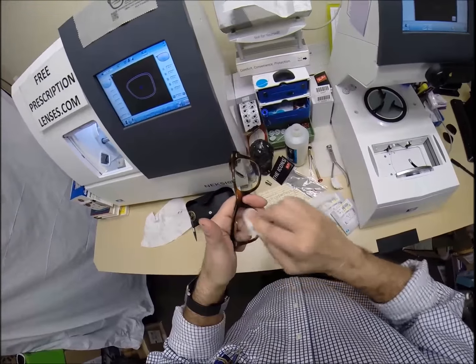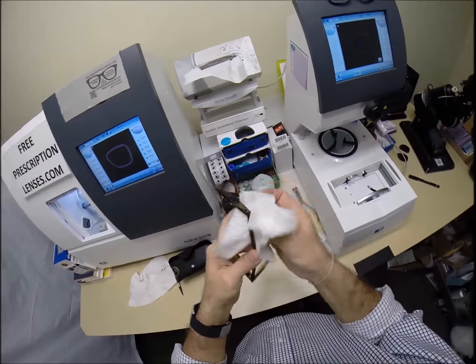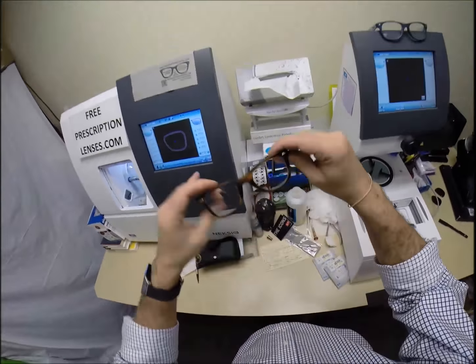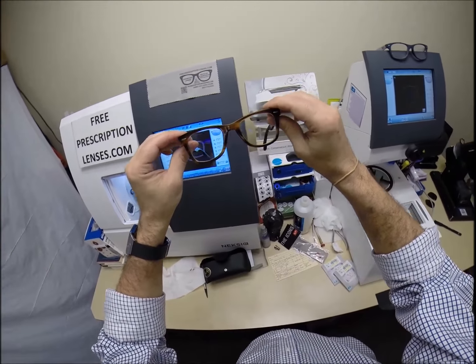However, there's an 80% chance that one side is going to sit higher than the other. That's because 80% of people have one ear that is higher than the other. And because of that statistic, 99% of all optical shops will do free adjustments if you ask them.